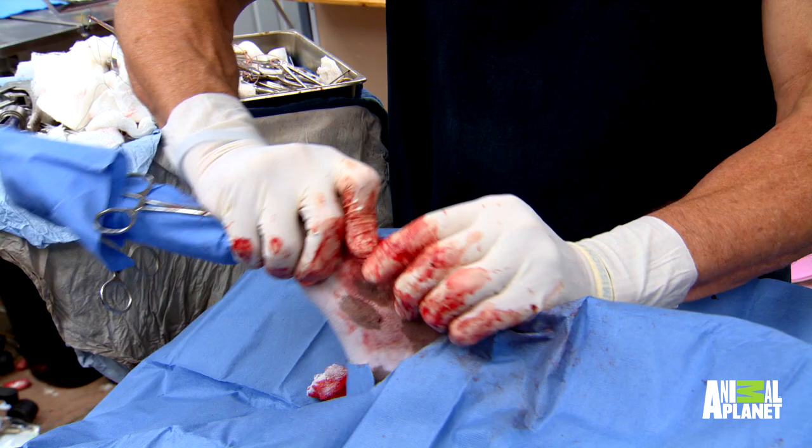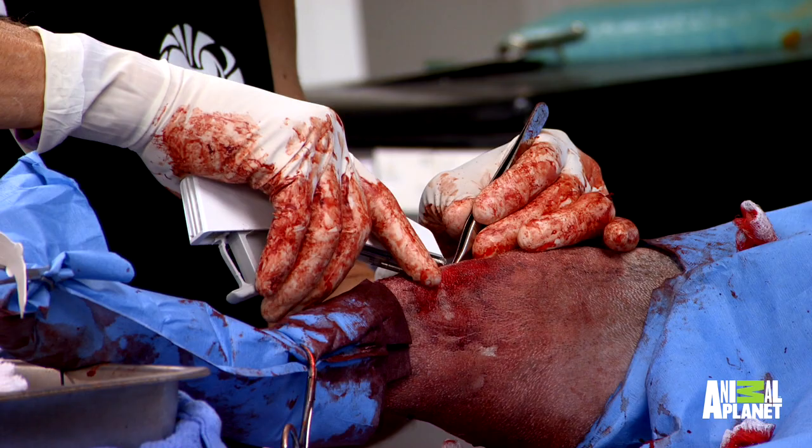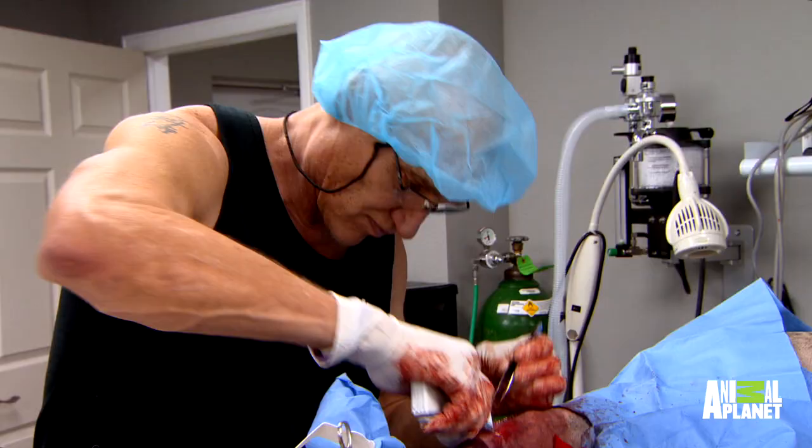The knee bends 90 degrees, which is what I want. Over time, the body forms scar tissue around the band, and that scar tissue is the long-term stability. She'll be running on that knee in a few months.